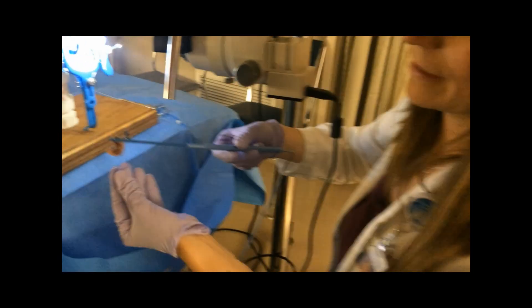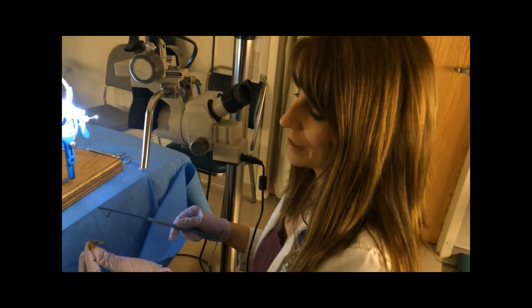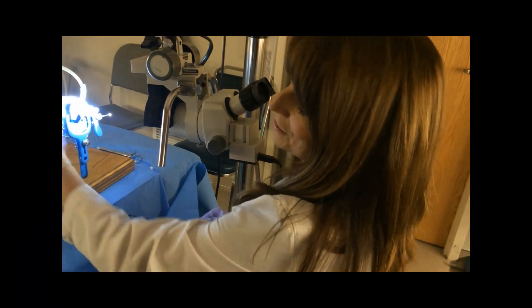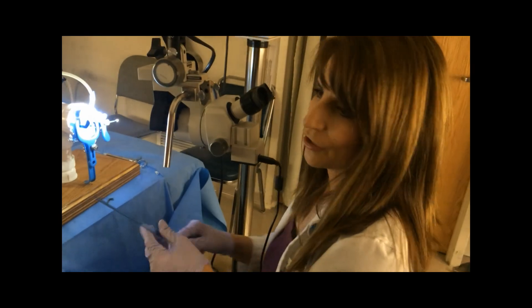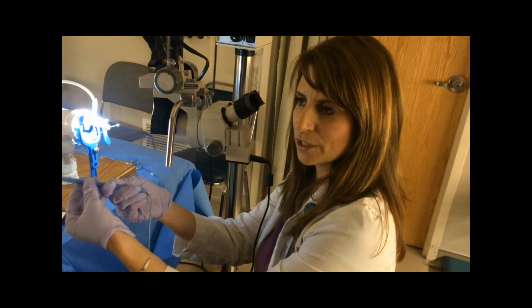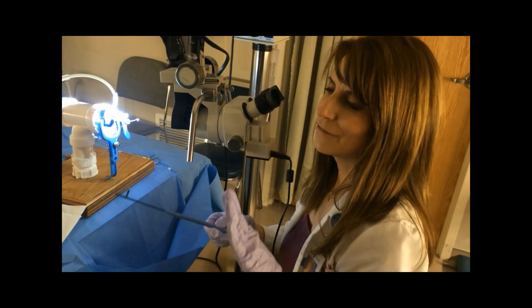There's my specimen — that is what it really does look like. I did have a little bit of technical difficulty with my sausage because I need somebody holding it so it doesn't move, since the patient normally would not have that issue. It's important that you start the electricity before you go into the cervix and then keep the electricity on the entire time until you come out. That's very important.